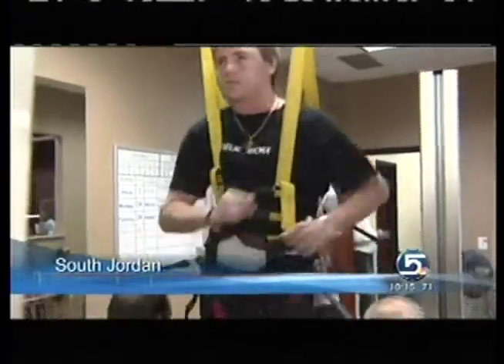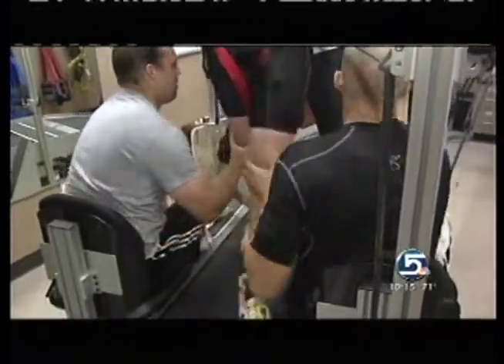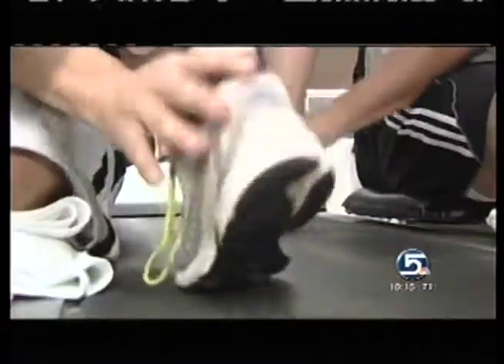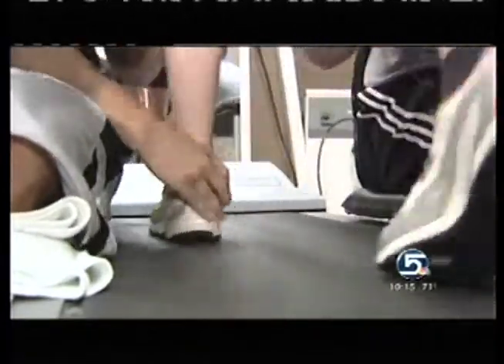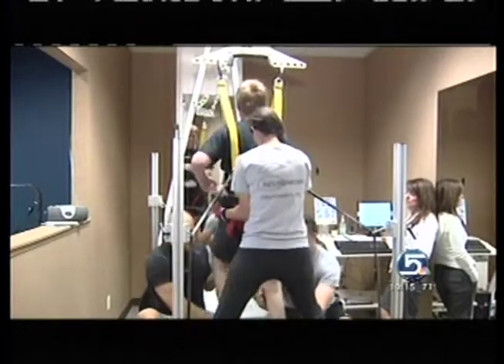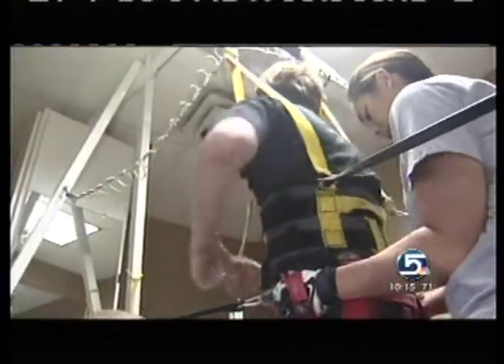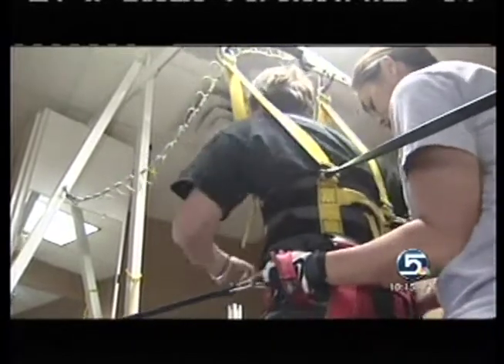On this machine called TheraStride, quadriplegic Jared Blackman is pushing the envelope. In fact, that's why he chose Utah's nonprofit Neuroworx, one of only 5 U.S. outpatient centers with this equipment, and why he came here from his home in South Africa. I've seen lots of people rolling here in wheelchairs and walk out, so my goal is just take it one step at a time and get as much movement as I can.